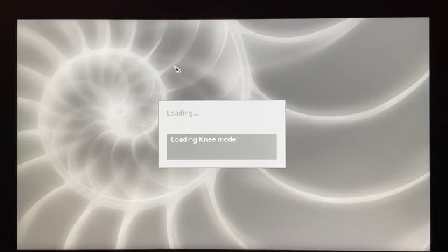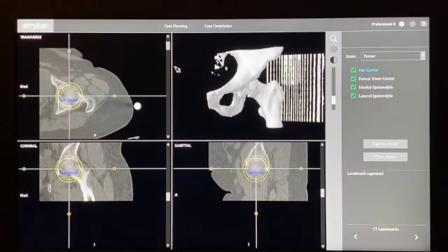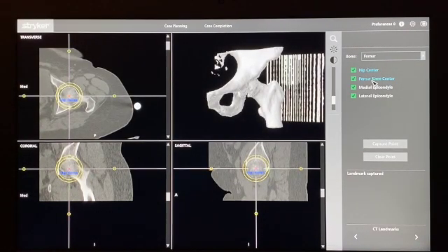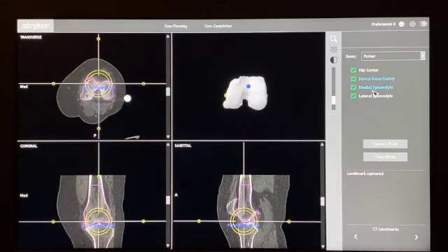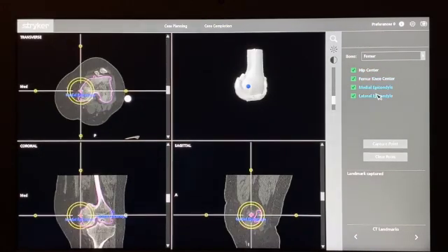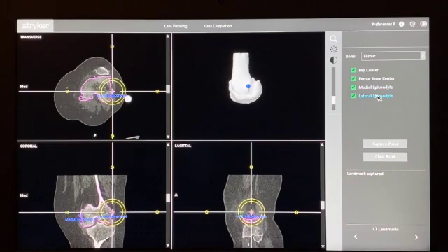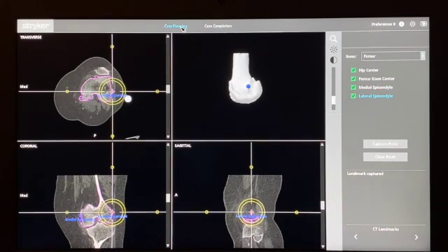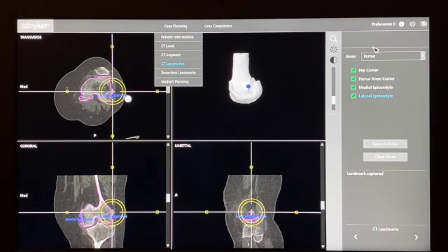I think it's also very important in knee replacements to look at the CT model and ensure that the landmarks as plotted by your Mako product specialist are the same as you would plot yourself. That way you can ensure that the alignment and the angles that you're reading in the plan correspond with what you think should be done for this patient.